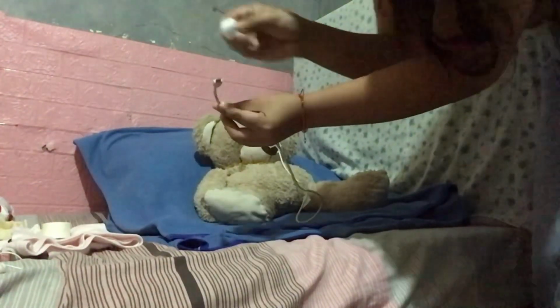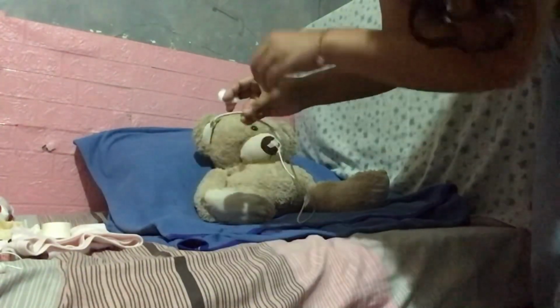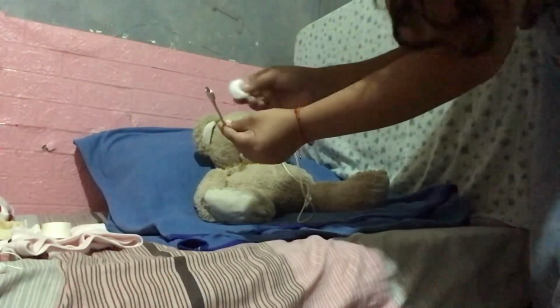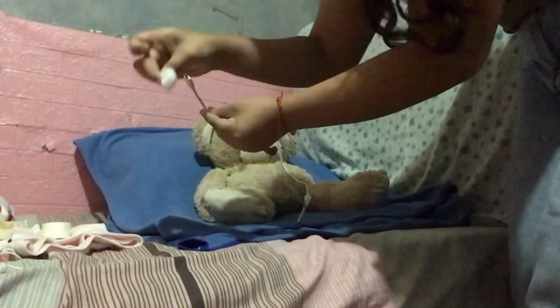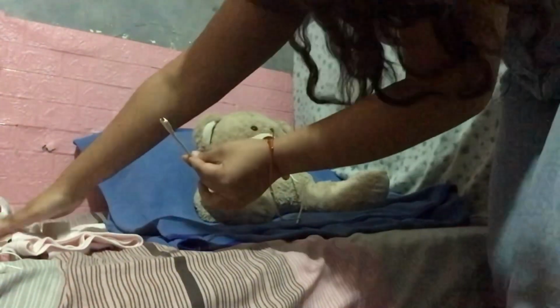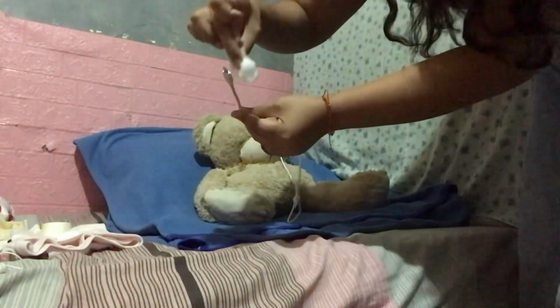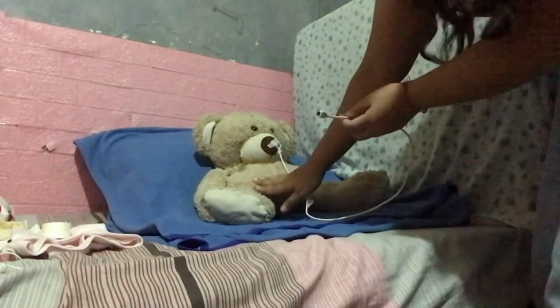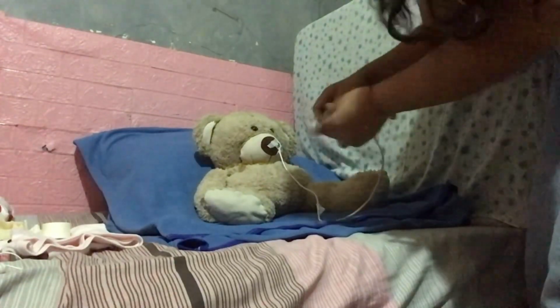So you have to hold the penis of the patient in your non-dominant hand, and then in your dominant hand the cotton ball. So first you have to clean the tip in a circular motion like that, and then you have to change with the new cotton balls with antiseptic solution, just like that, in a circular motion. So do this until it's done. So of course you have to clean the scrotum and the thigh area of the patient.